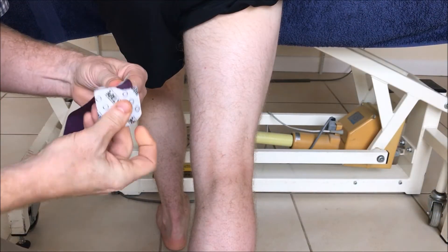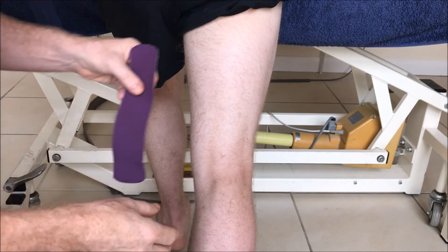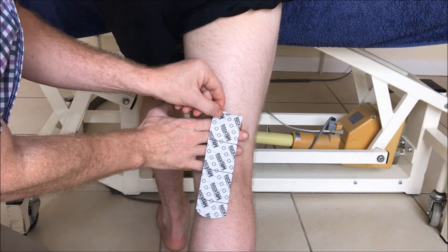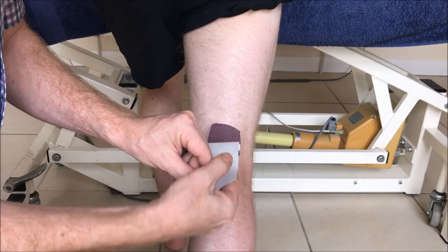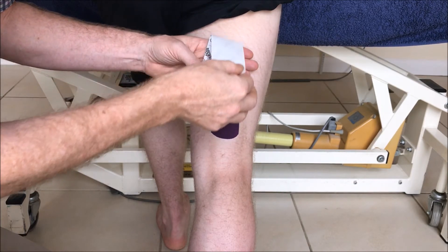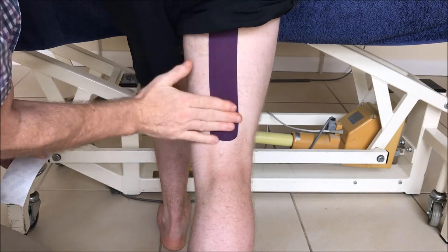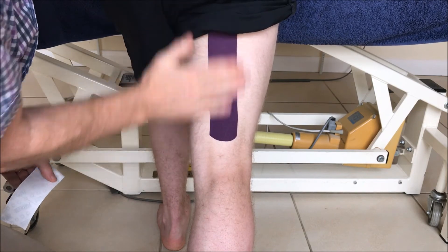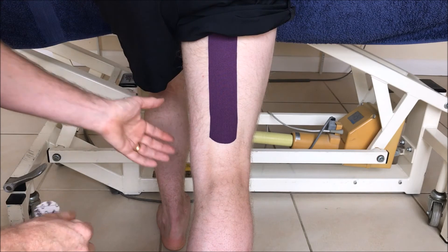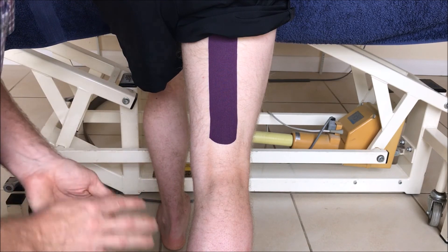Now, to stimulate the hamstrings a bit so that they protect the joint a bit more, we can place just a normal strip down the middle of the hamstring. There's our anchor — put a bit of stretch on it and just lift it up there. Make sure it glues very well and activates. This will help stimulate the hamstring so that we don't have too much mobility in the joint and the edema has a chance to actually disperse.